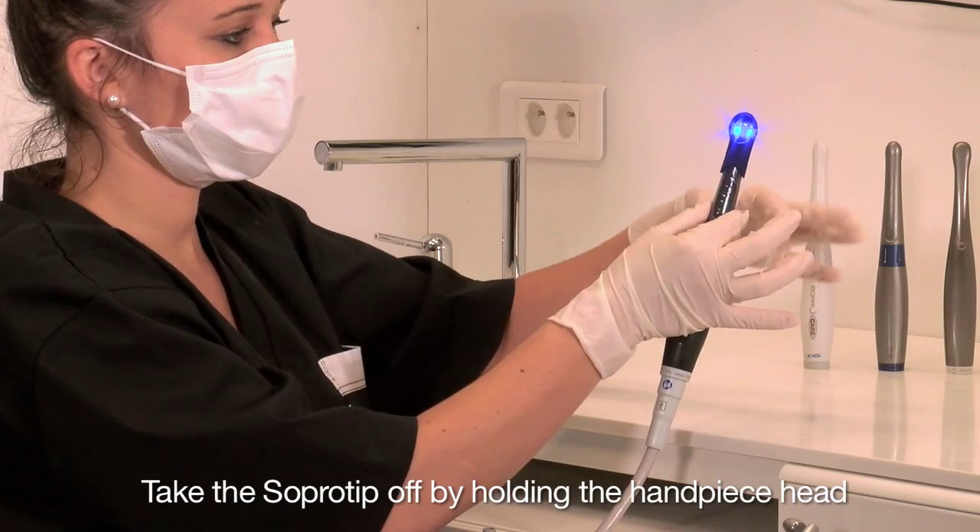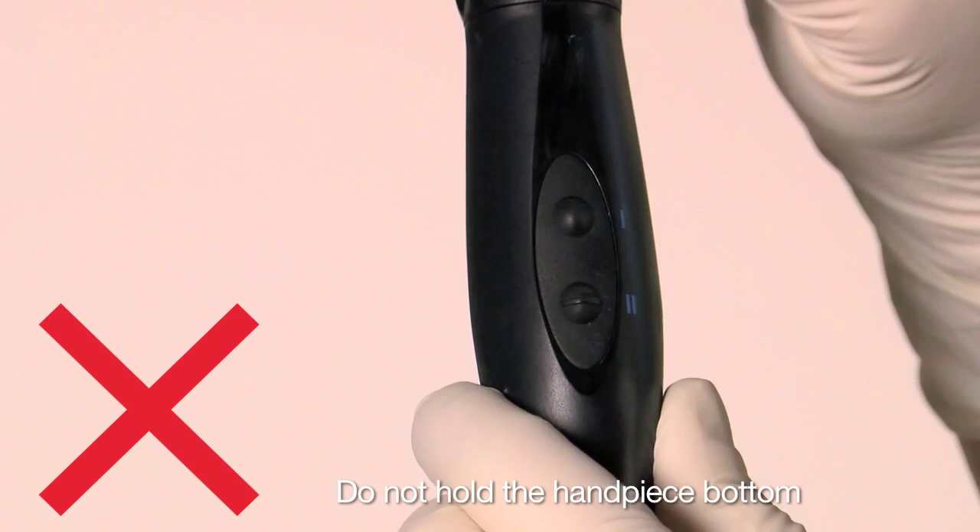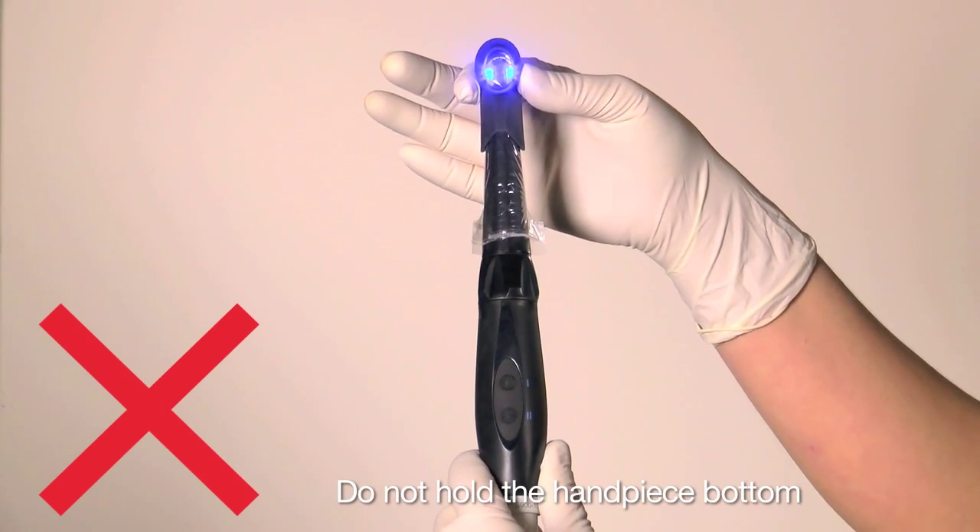Take the SOPRO tip off the camera handpiece by holding the head of the camera handpiece. Do not hold the bottom of the camera handpiece when you remove the SOPRO tip.